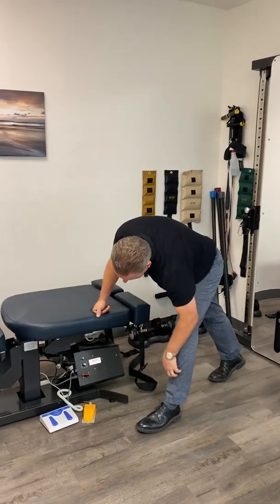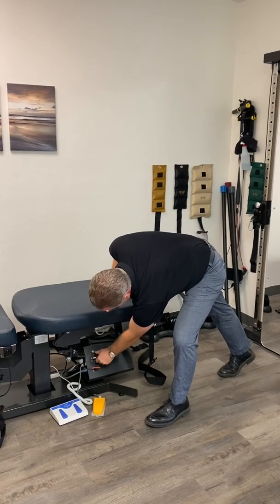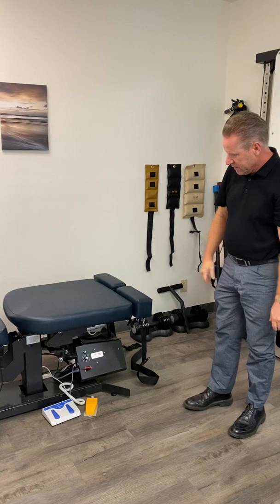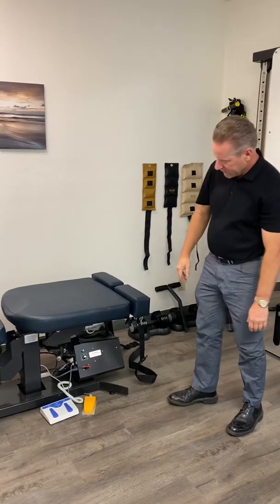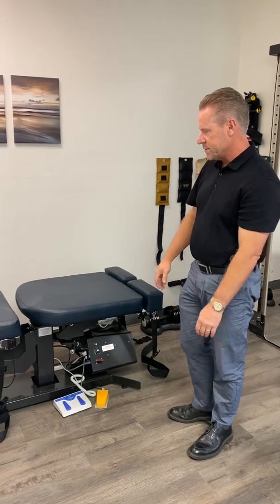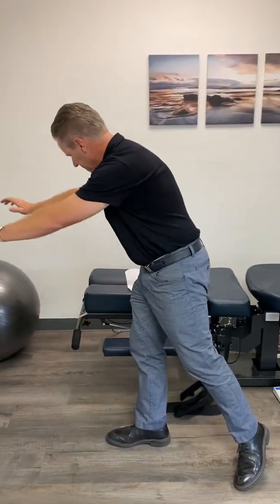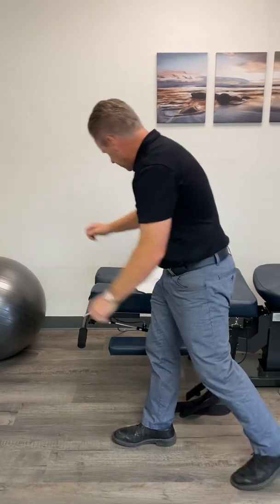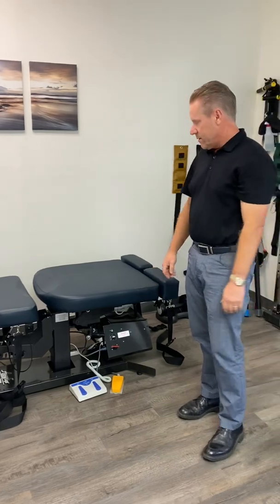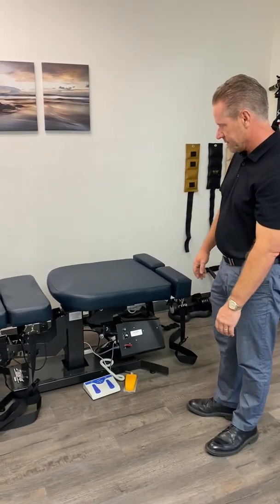And for the motion device, we're gonna go really slow. We always start slow, so I'm going down here at like 10 degrees per second, just because you don't wanna have anybody surprised. I'll be kind of talking through the features as we go, but there's an adjustment up here if you want to extend the bars out. These are what the people hold on to, but as I'm setting my mom up on this, I'll go ahead and just kind of discuss the various features.